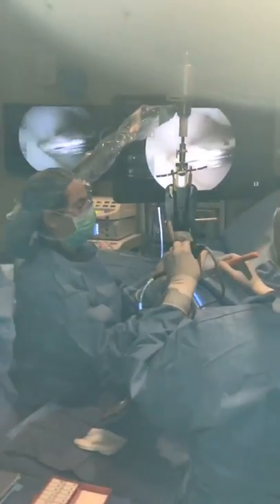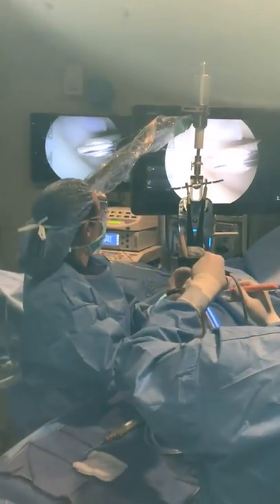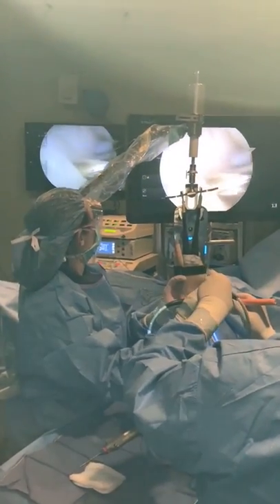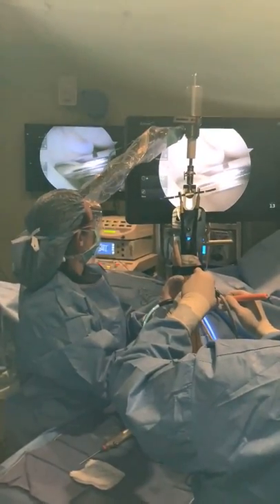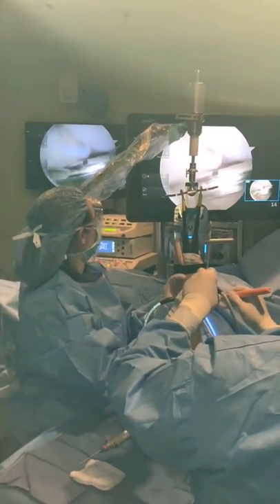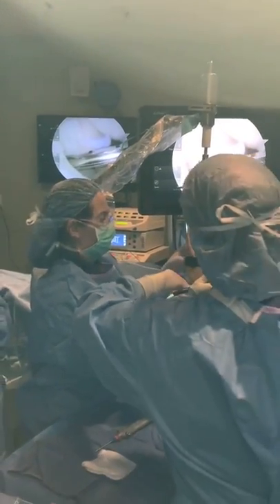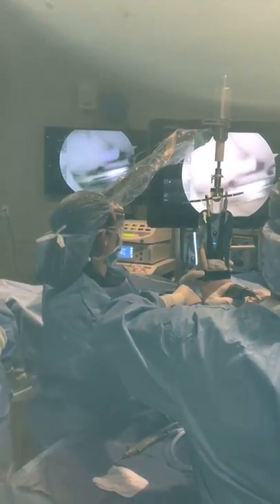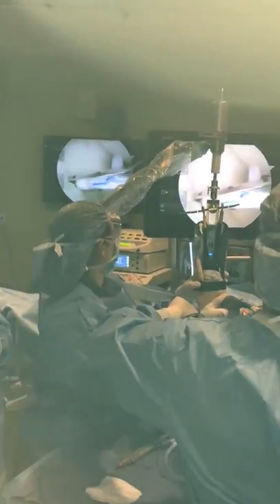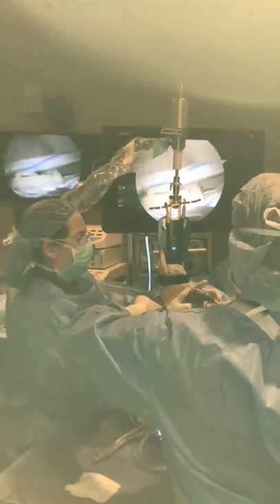Okay. We got pretty good visualization. I'm going to take some pictures so this way we can document what we've done. Okay. What do you think? Right about there, right, Kate? So now I'm going to pierce that. There's a little structure that's going to go on the other side of the capsule and grab the capsule.